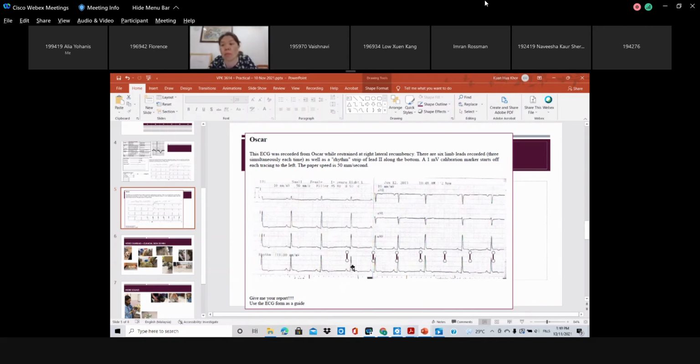So the heart rate would be 120. Okay, so I'm not going to fault you all if you write 100 and 120. I will mark everything as correct. Only unless if you say, Doctor, the heart rate is only 40 and my answer is 120 and jauh benar, then it means your calculation is wrong.